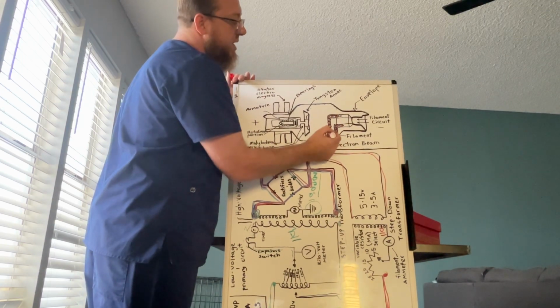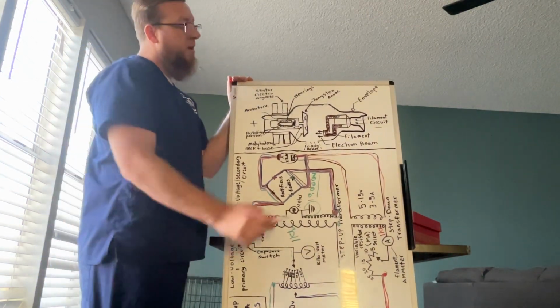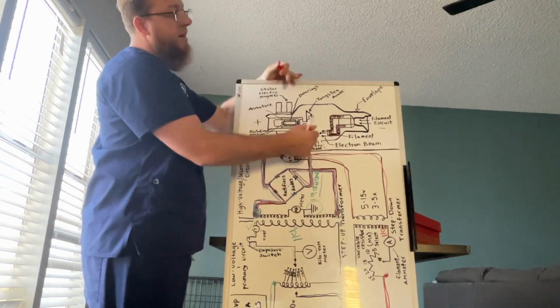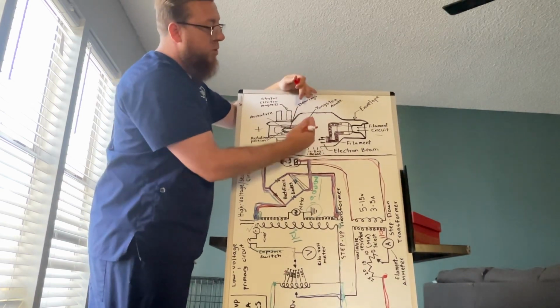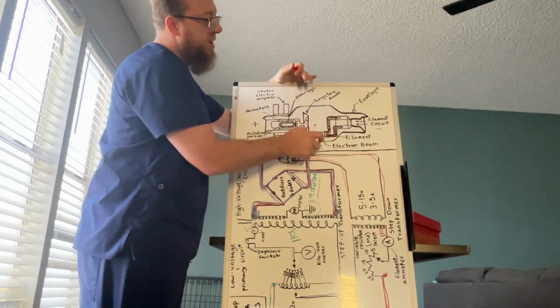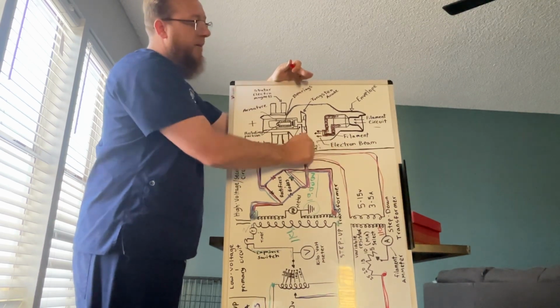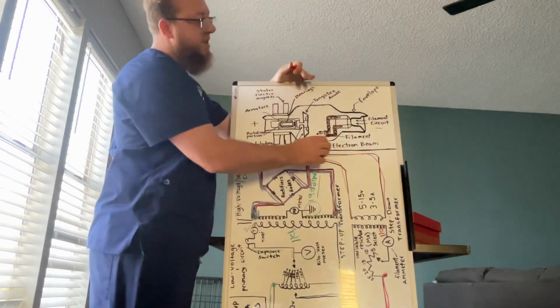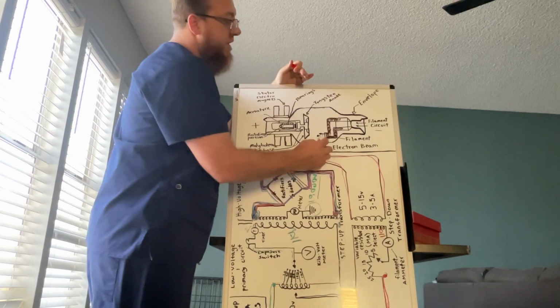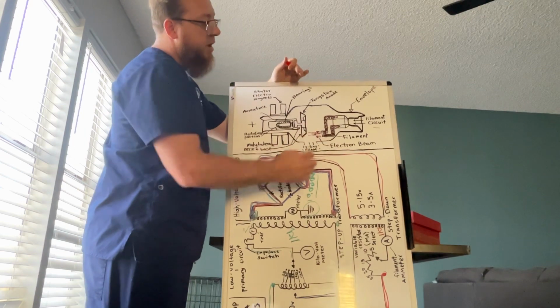And what these do is we have the law of repulsion and attraction. These are going to repulse the electrons that are coming out, and condense them into a thin straight line, so we can get a direct point of contact, a direct stream, a direct line of our electrons. Once the electrons leave the filament, thermionic emission is going to happen. Once that happens, our electrons are going to start shooting in a direct line towards the anode.